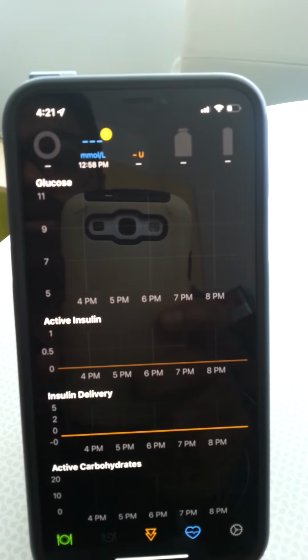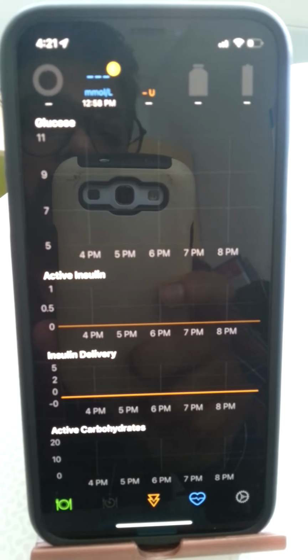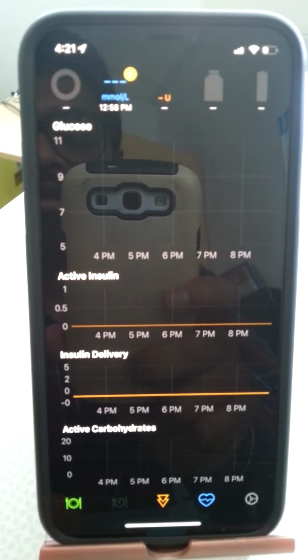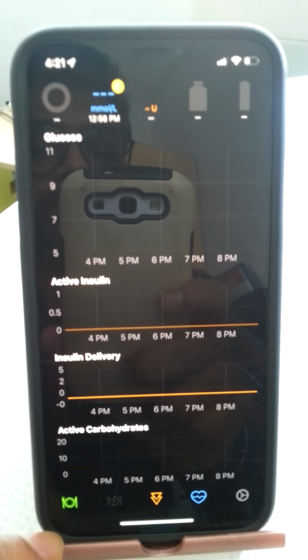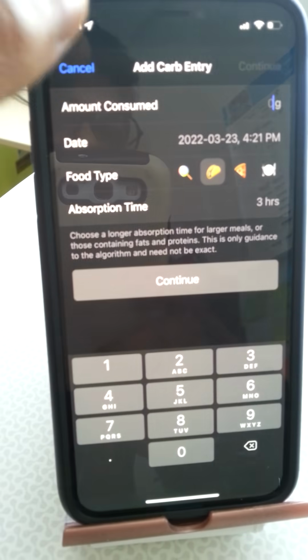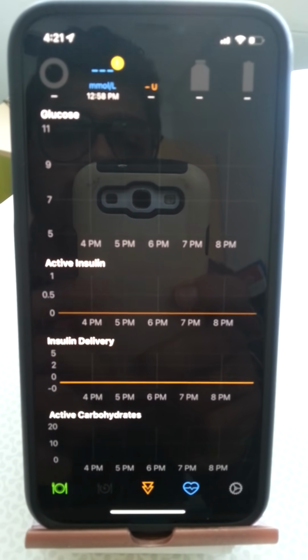That was a quick overview. If you are doing it for your first ever time, we recommend doing it under supervision or with someone who has done it before. Installation and setup are straightforward. You'll spend most time learning about your carb entry, its absorption time and glycemic index. Otherwise, the setup is quite simple.